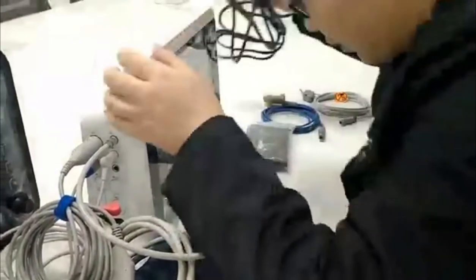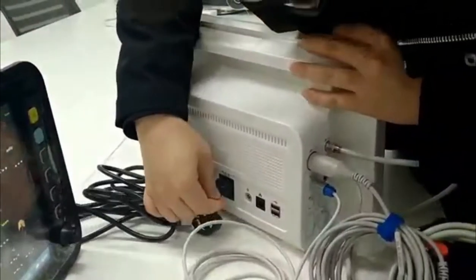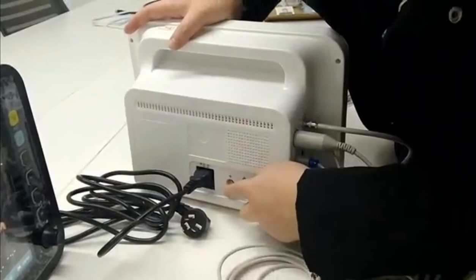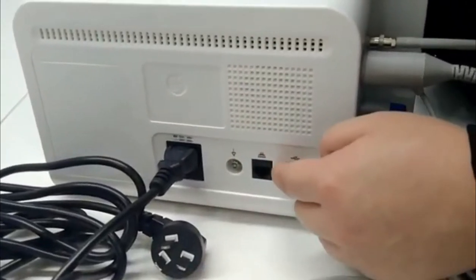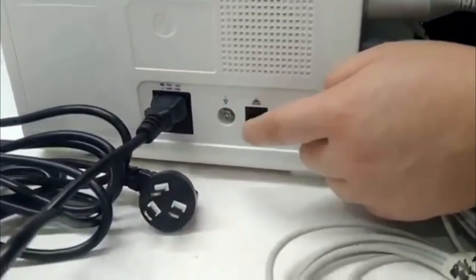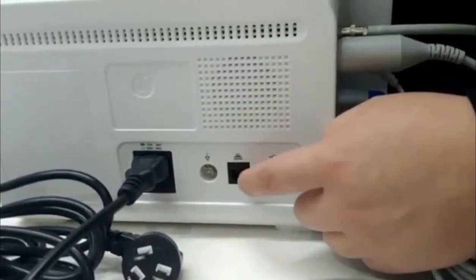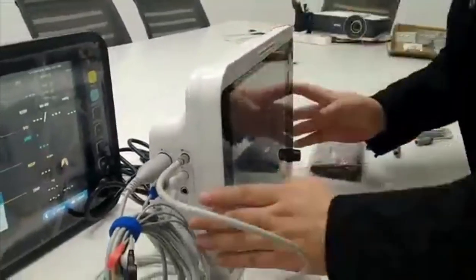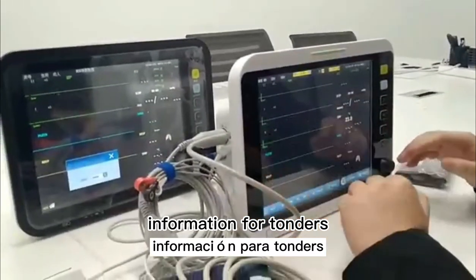The power wire connects at the back side. This connector is for the ground wire. This one is for connection to a computer — normally for the central monitor station. This is for the USB pen drive. This is the basic information for the 12-inch monitor. Thank you.